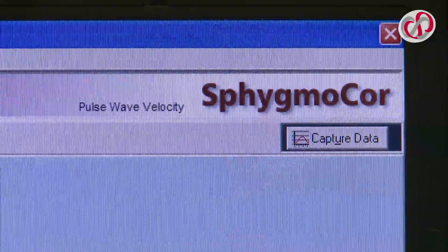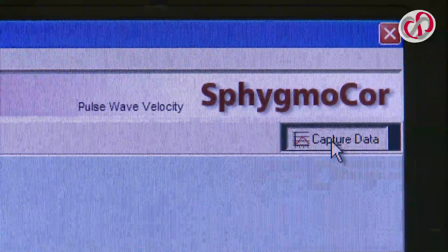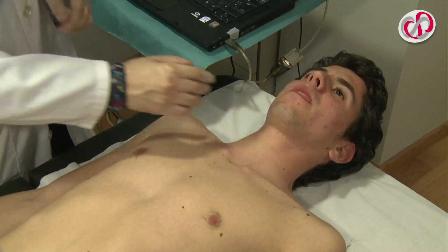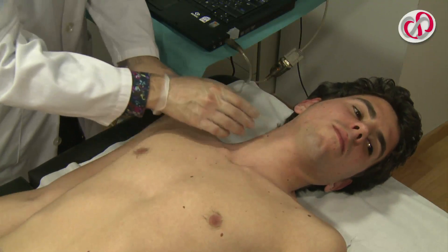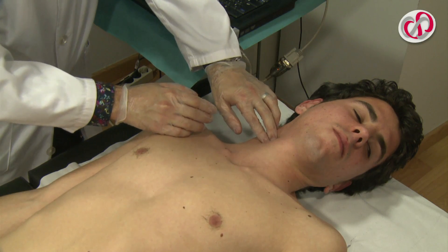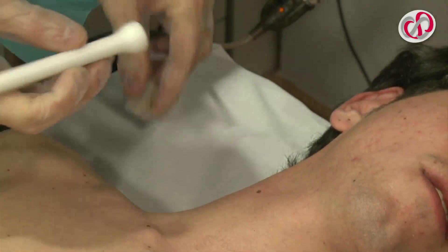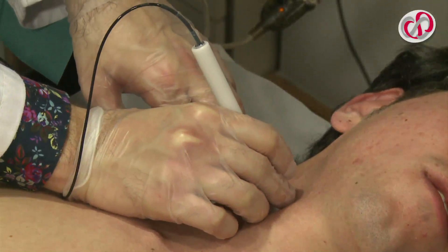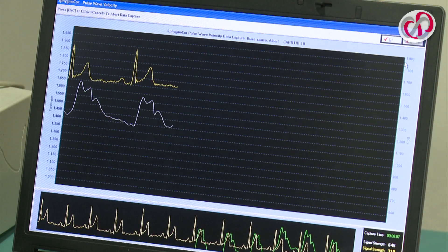Select Data Capture on the screen. The message 'Carotid site' will appear — click Accept. With the head gently tilted to the left, we look for the carotid pulse again and apply the tonometer to that point. A strong, stable and reproducible wave must be obtained that we can register for some 10 to 30 seconds.